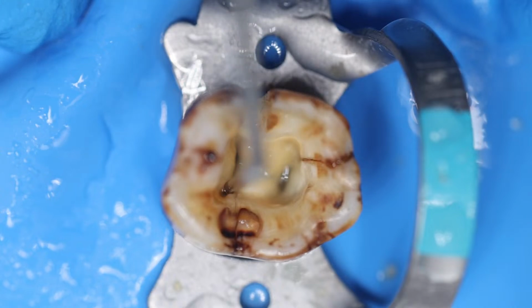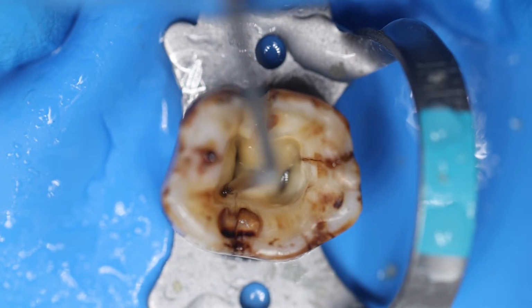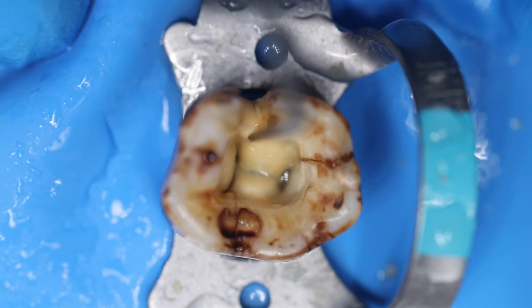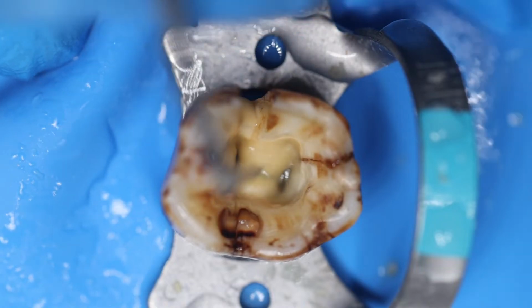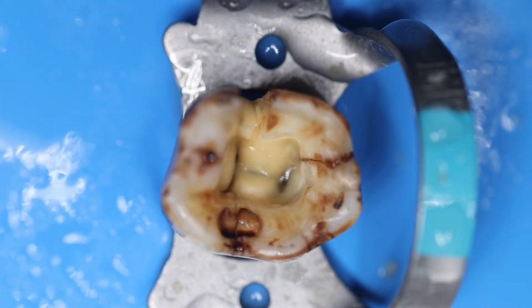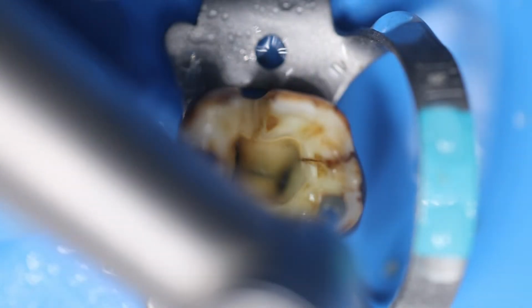Again, look for the other mesial orifices, mesiobuccal orifice, then the mesiolingual orifice. So this is the access that we are getting. We can now remove the other stains that are there, or remove the caries that is there. Again switching on to the round bar and removing the other stained areas or the carious areas that is there.